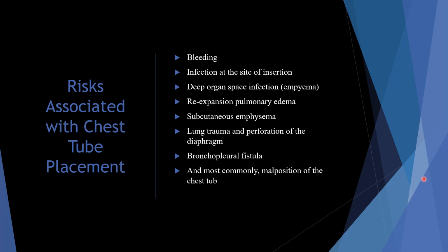So this is something that you need to really make sure you're monitoring and looking at on your patients with chest tubes. But know that it is common to have a little bit of a cough after. Now, if you put a central line in and you start getting a little cough like that, you need to get a stat chest x-ray because that means they probably have a pneumothorax.